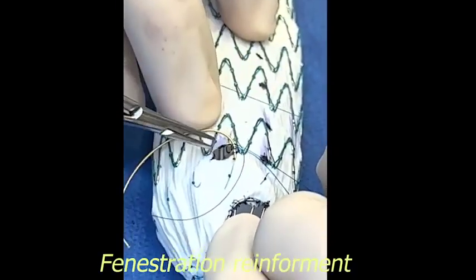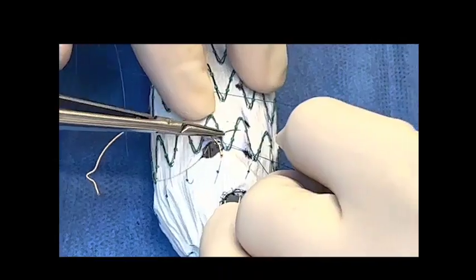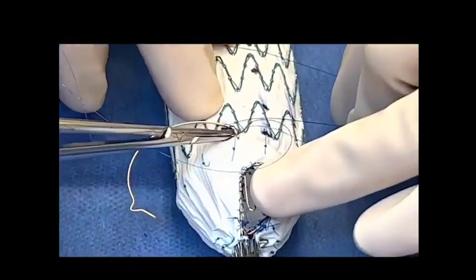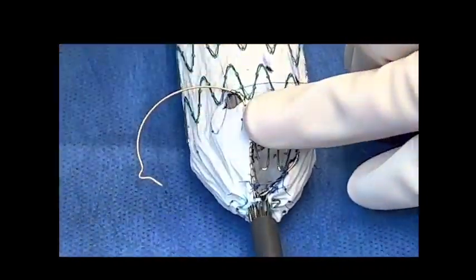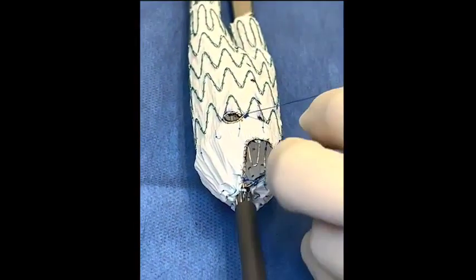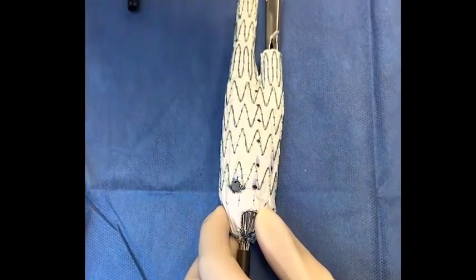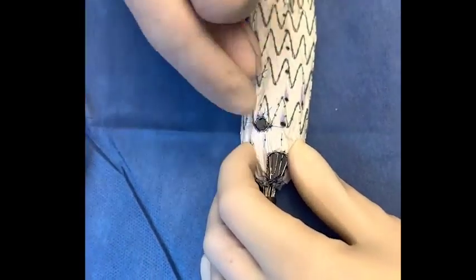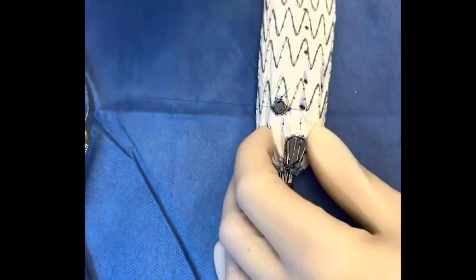Here you can see that we are reinforcing each fenestration with same nitinol gold gooseneck snare in running circumferential fashion. Each of the four corners of the fenestrations are then secured with additional figure of 8 sutures.